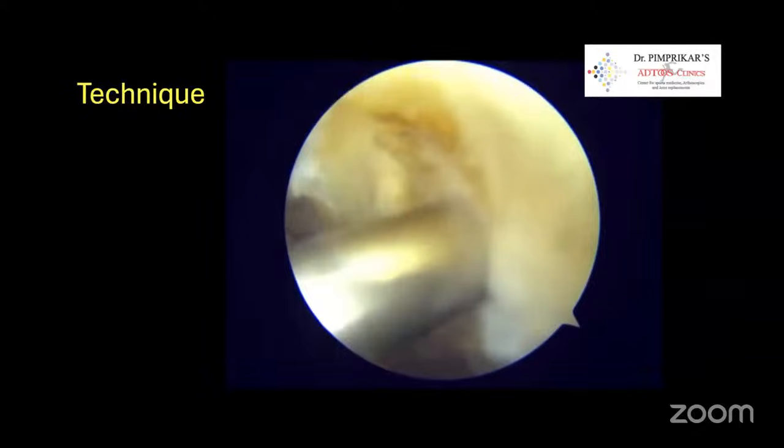So you push in a beath pin, which is over-drilled with a 4.5 millimeter endo button drill bit. The tunnel length is measured, and a definitive drill is used to create a socket where one can put the femoral PCL. I use a suspensory fixation on the femoral side and a bio screw or a metal screw on the tibial side.